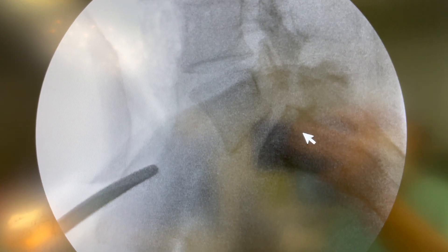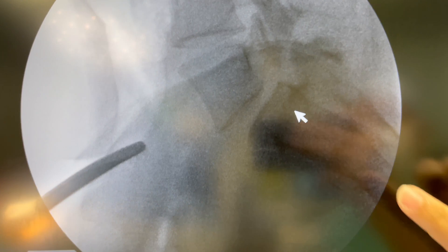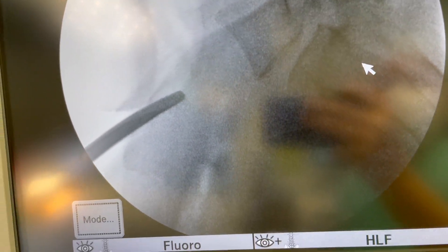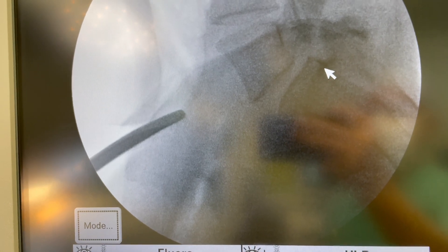If you look at the back of the bone below — put the arrow on the back of that S1 bone — the back of that bone and the back of the bone above it don't line up.